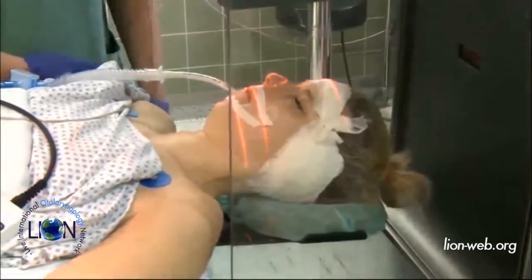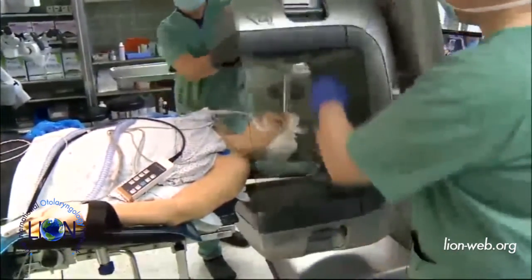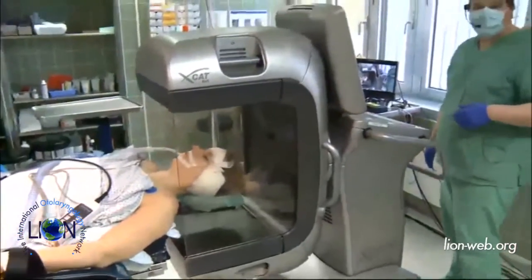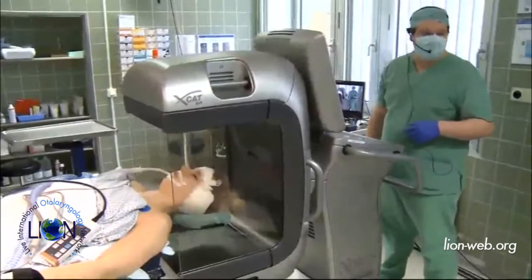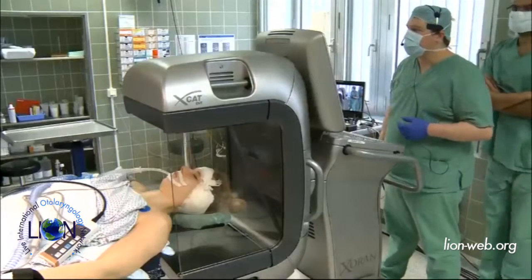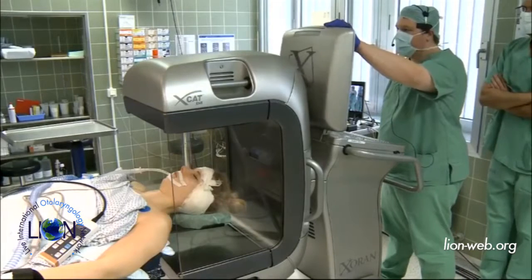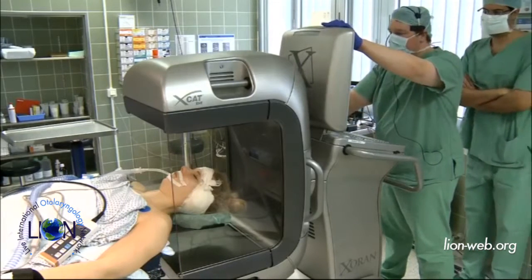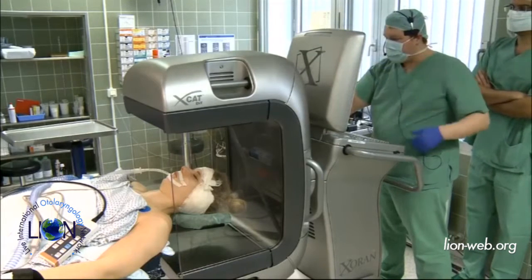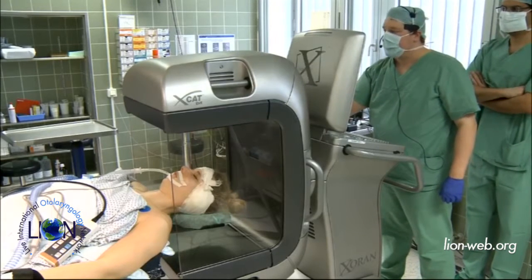Do you need any protection? Not specially. It's like a 1.5-meter X-ray area around the system, and the patient does not need any special prevention for X-ray. I was on a special course some weeks ago and a physician also said it's not necessary. So now we will just start rotating — activate the system.